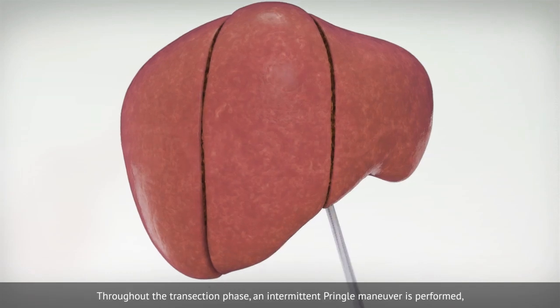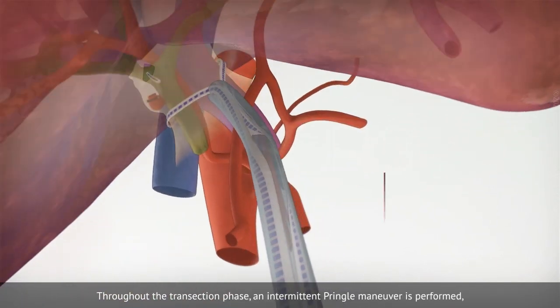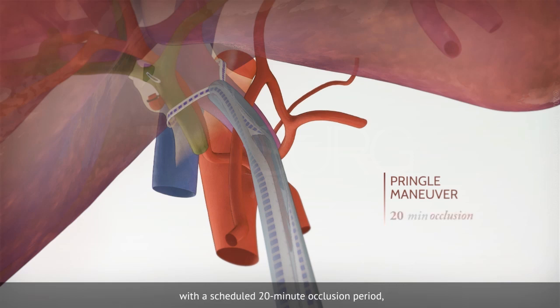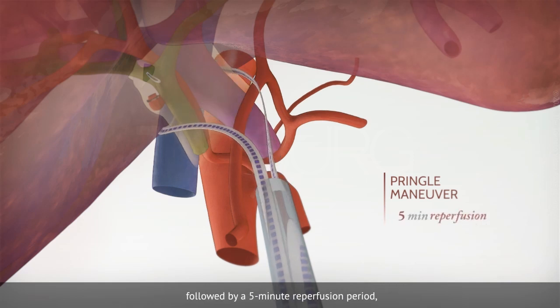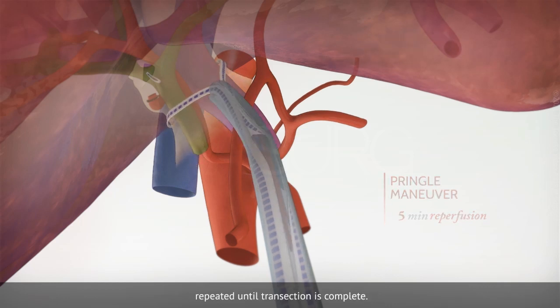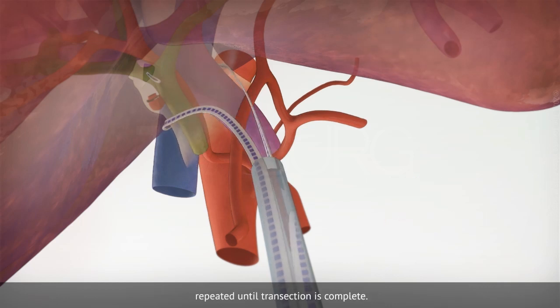Throughout the transection phase, an intermittent Pringle maneuver is performed, with a scheduled 20-minute occlusion period, followed by a 5-minute reperfusion period, repeated until transection is complete.